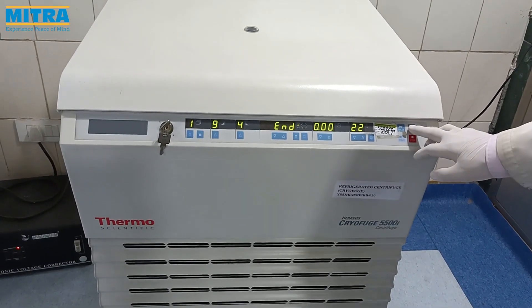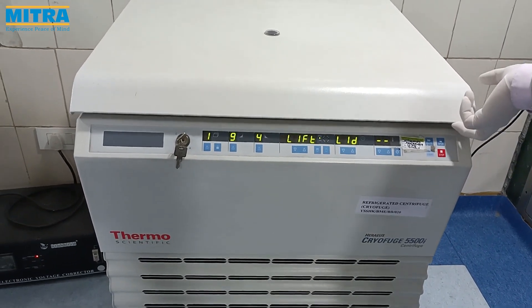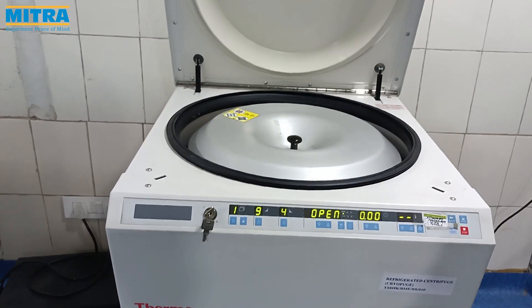As we can see, centrifugation is now over. Open the lid and take out the centrifuge buckets. Now we separate the components from it.